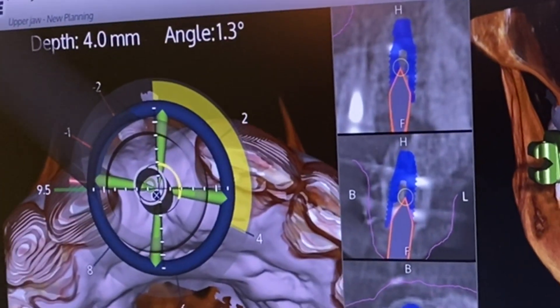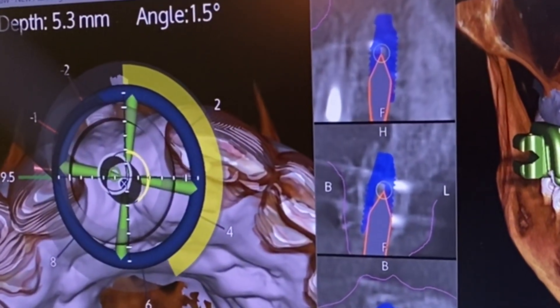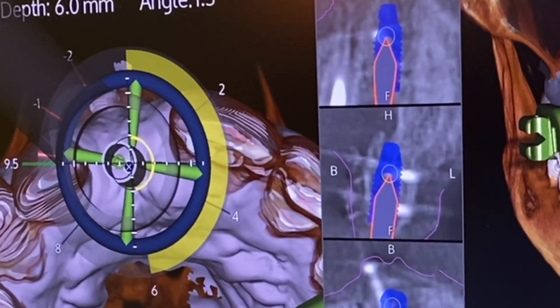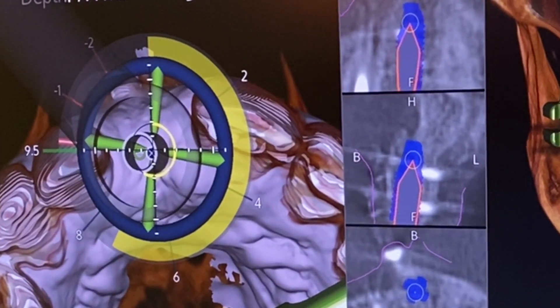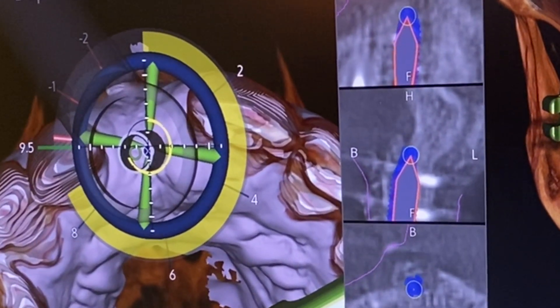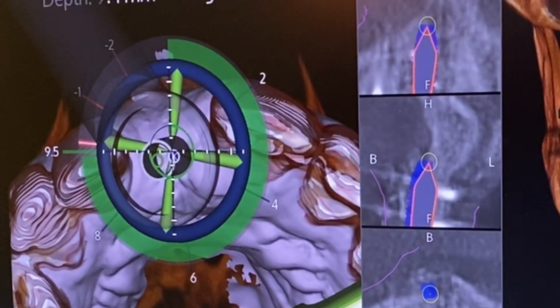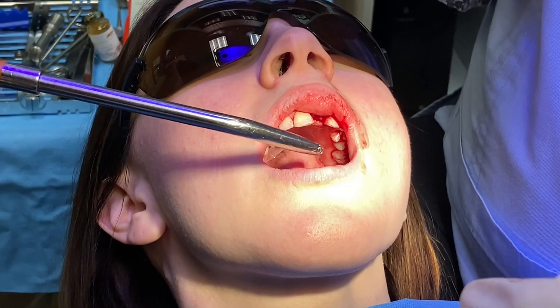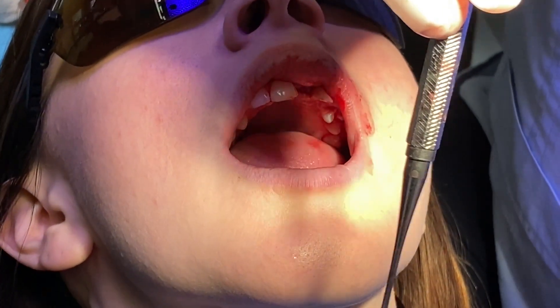I'll be watching the screen, and the patient access is managed by the dental assistant — she's holding the tissues and everything out of the way. As I place the implant, we get it exactly into position, and the computer will give us feedback and say you're right there. It's green, which means we're good and we've got the implant to the right depth.